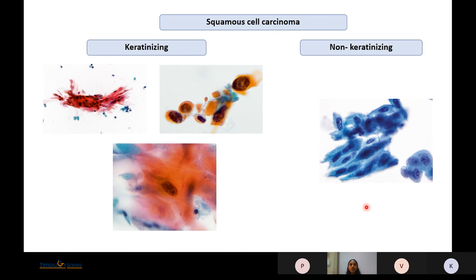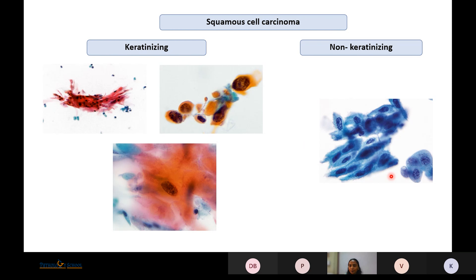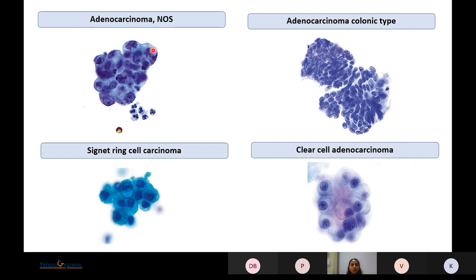Non-urothelial tumors include squamous cell carcinoma, showing keratinized cells with atypical nuclei having irregularly clumped chromatin and nucleomegaly; anucleate squamous cells indicate keratinizing squamous cell carcinoma. Non-keratinized squamous cell carcinoma shows basophilic cytoplasm with slightly angulated hyperchromatic nuclei. Adenocarcinoma presents as clusters of cells with eccentrically placed nuclei and a single cytoplasmic vacuole; subtypes include colonic type, signet ring type, and clear cell adenocarcinoma showing hobnail cells with a centrally placed nucleus and prominent nucleoli.